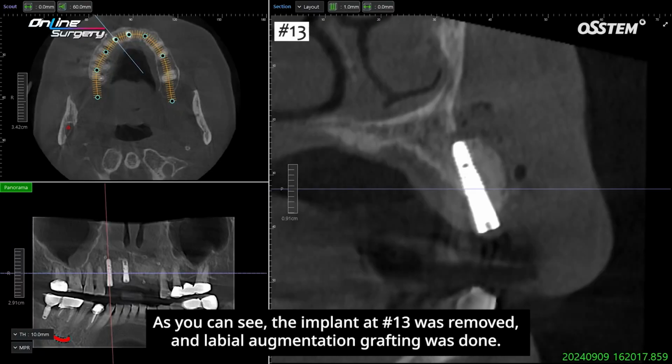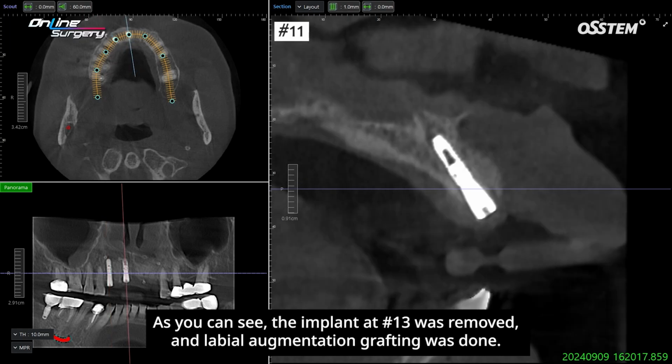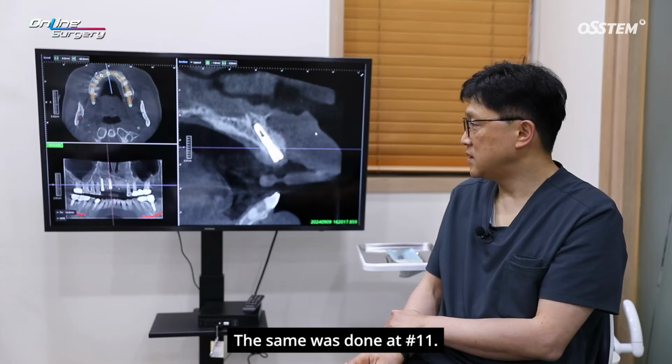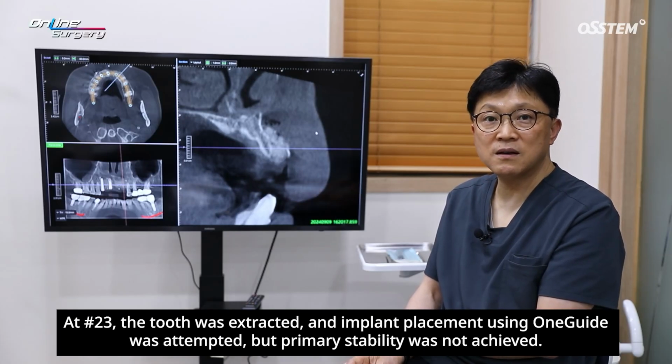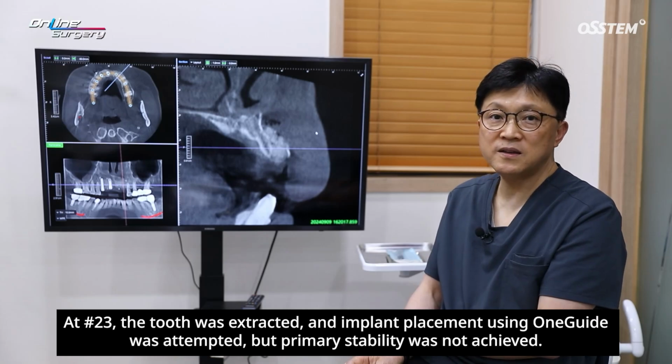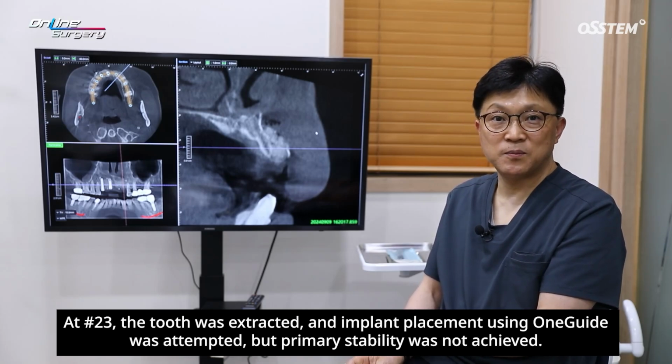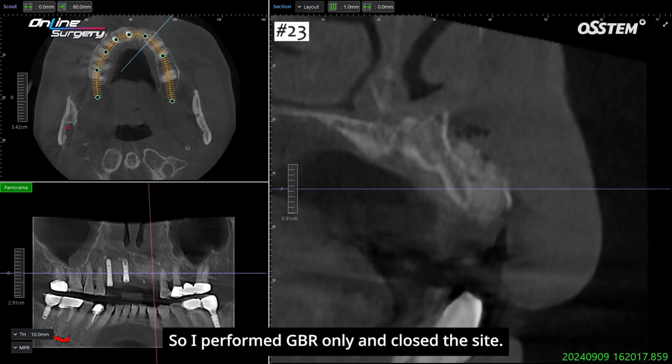As you can see, the implant at number 13 was removed, and labial augmentation grafting was done. The same was done at number 11. At number 23, the tooth was extracted, and implant placement using OneGuide was attempted, but primary stability was not achieved. So I performed GBR only and closed the site.